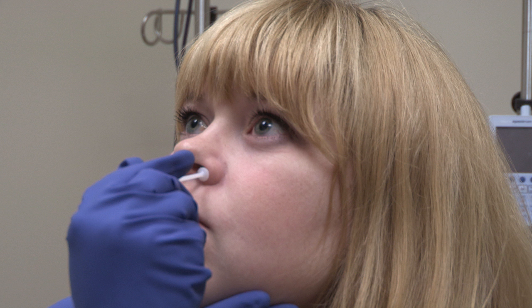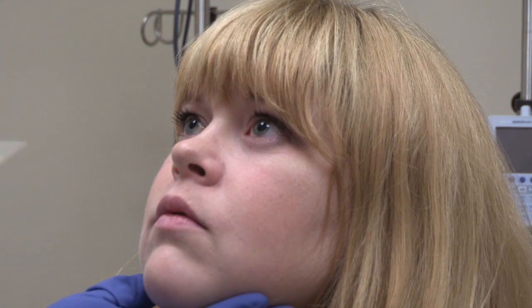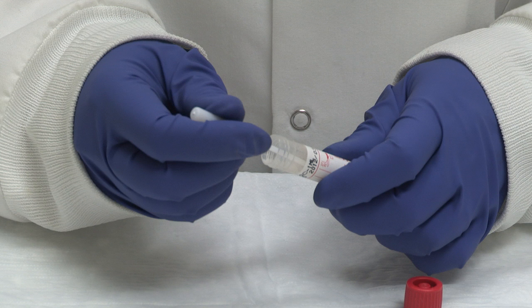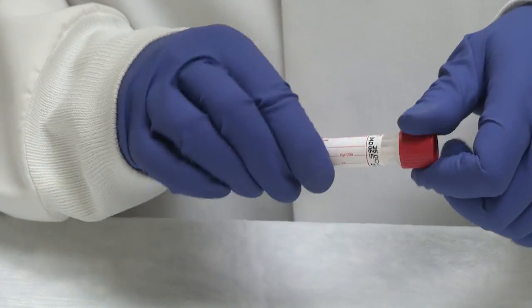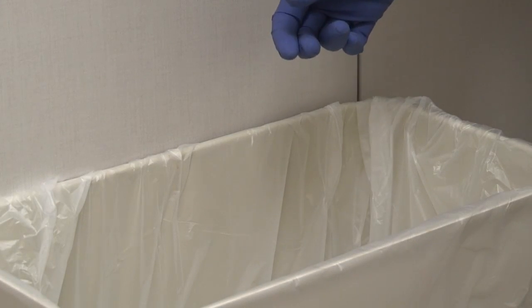The stopper on the swab shaft indicates the depth of sampling required. Avoid touching the swab applicator below the molded breakpoint as this could lead to contamination and incorrect results. Gently remove the swab from the patient. Remove the screw cap from the tube and insert the swab into the transport container all the way to the bottom of the tube. Holding the swab shaft close to the rim of the tube and keeping the tube away from the face, break the swab shaft at the pre-molded breakpoint. Screw the cap on tightly to prevent leakage and dispose of the swab shaft in a regular trash receptacle.